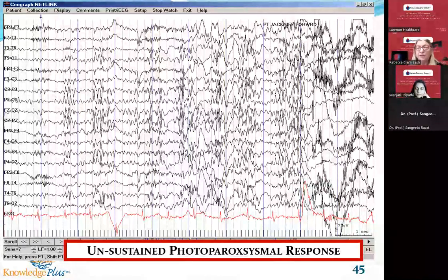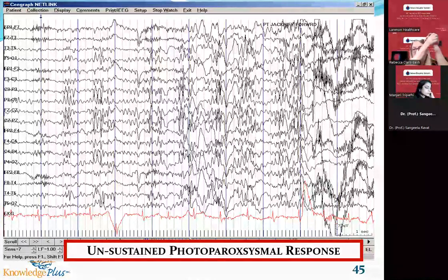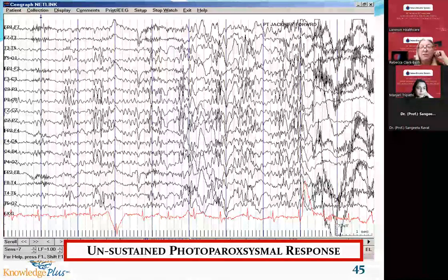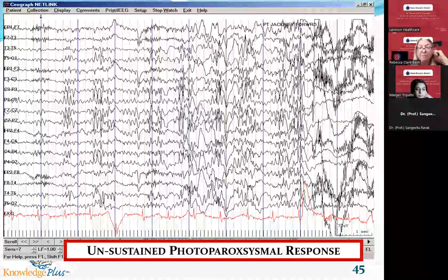So we go in there. It's this prisoner. And he's in this chair that reclines back. His hands and feet are still bound. And that's the most dangerous part about what happened next. So the tech goes in, she starts, and by the way, it looks like he has some very high amplitude posterior dominant rhythm, as you see here, and starts in second two, three, and then it becomes more generalized in the middle of the page. None of that high amplitude activity was present throughout his entire EEG. So this morphology is unique to the stimulation.